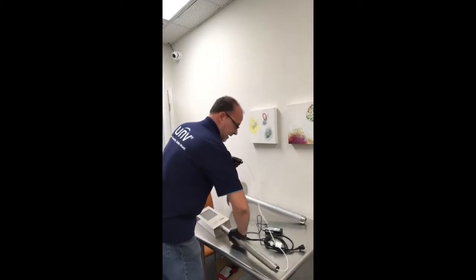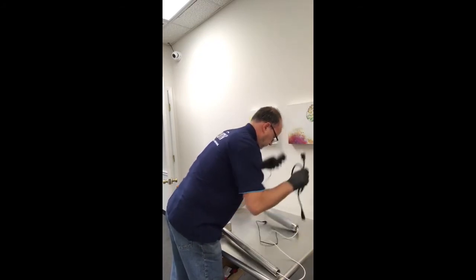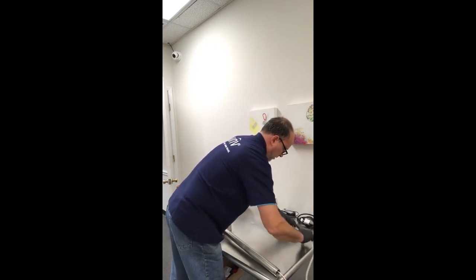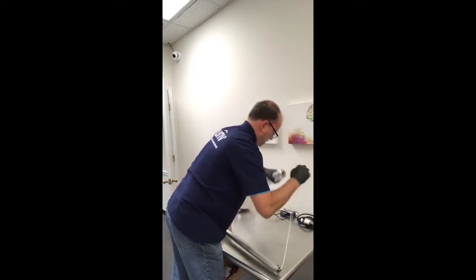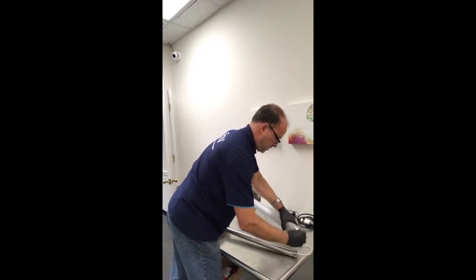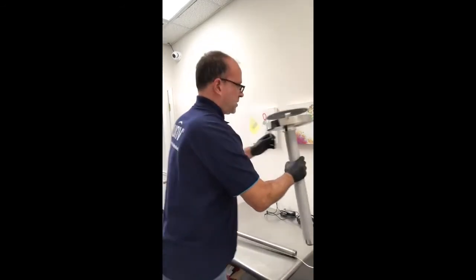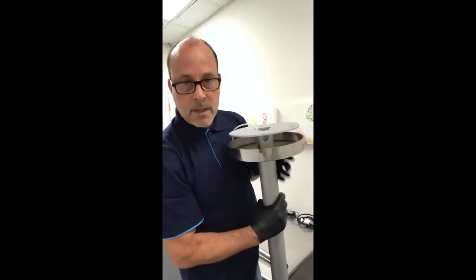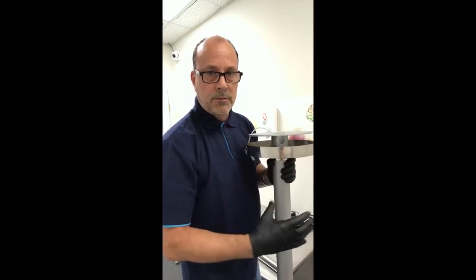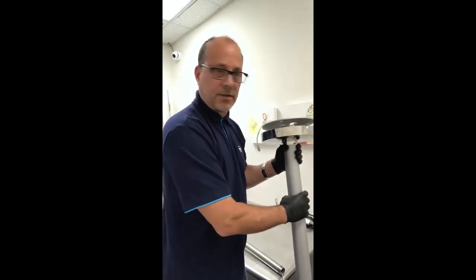Now we're going to feed the power cable down through the main mounting bracket. As you can see, there is a little seat in here where the cable comes through, to run it out the bottom of the mounting bracket without sitting it on the ground underneath the bracket.